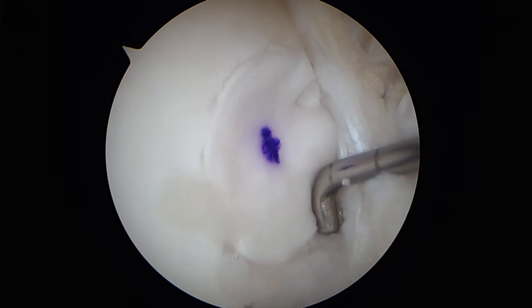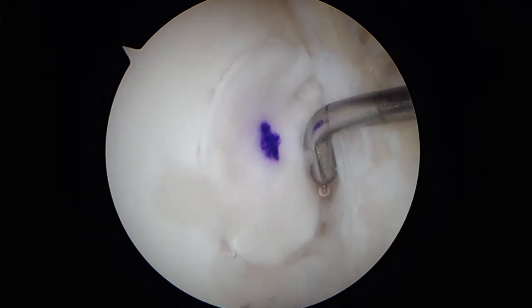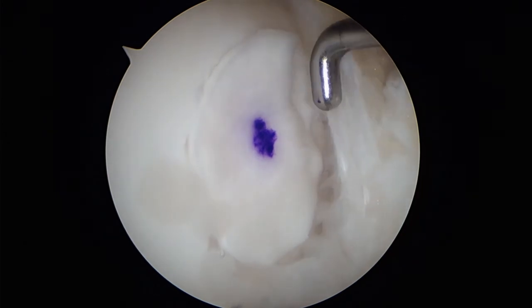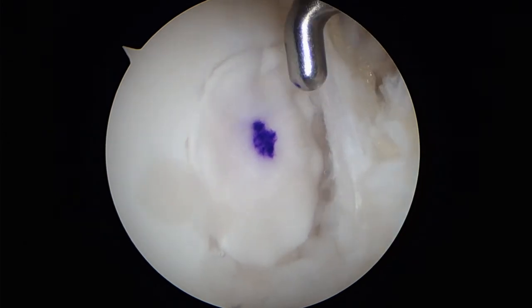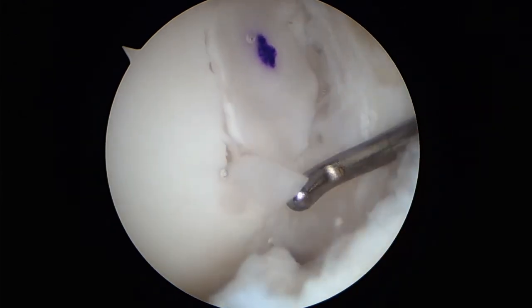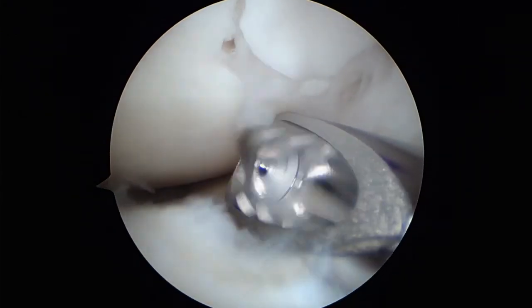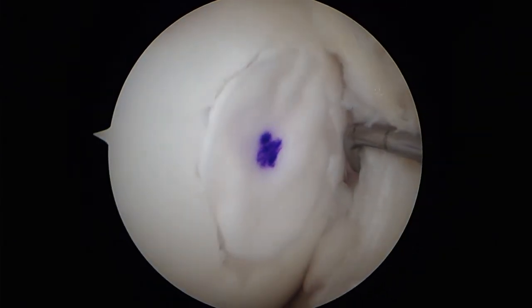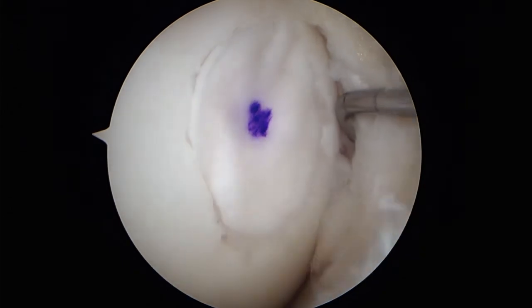Tamp the membrane down with an instrument. The membrane should not be proud to avoid hypertrophy of the repair tissue. Additional fibrin glue can be removed using a probe or a shaver. This is the final product at the end of surgery.